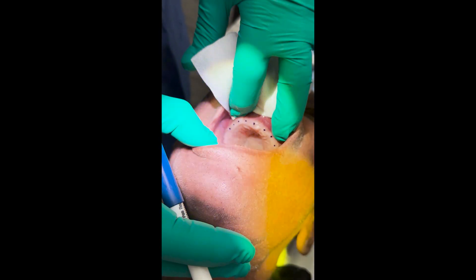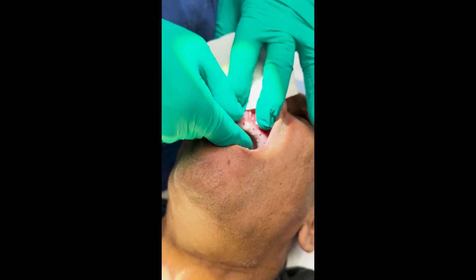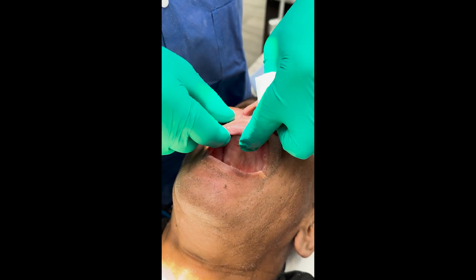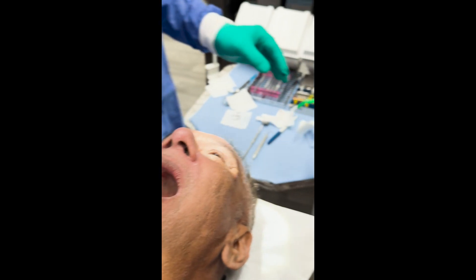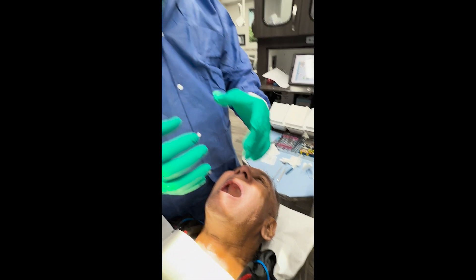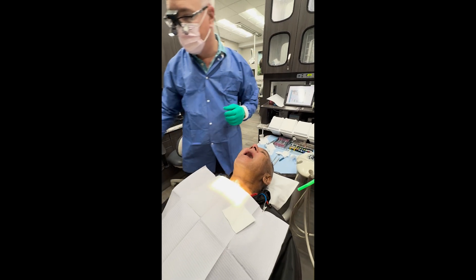He's already been anesthetized. You can see he's had a lot of bone loss. He's got a narrow ridge and he doesn't have any lip support because he lost those teeth. If you see his denture, it's a very, very large flange. So we're going to do the Xantex to give him that lip support that we need.